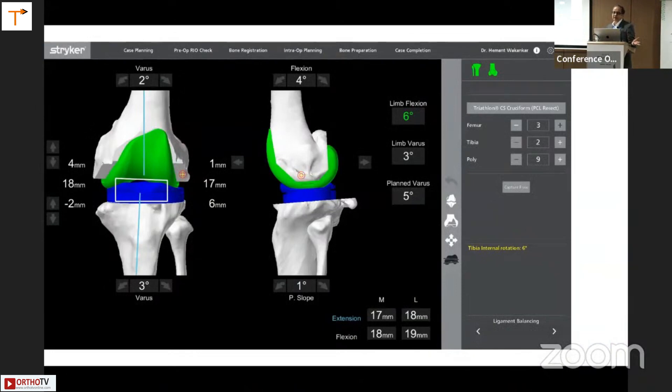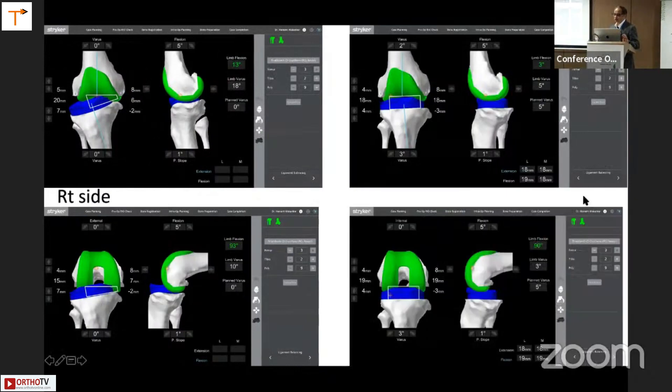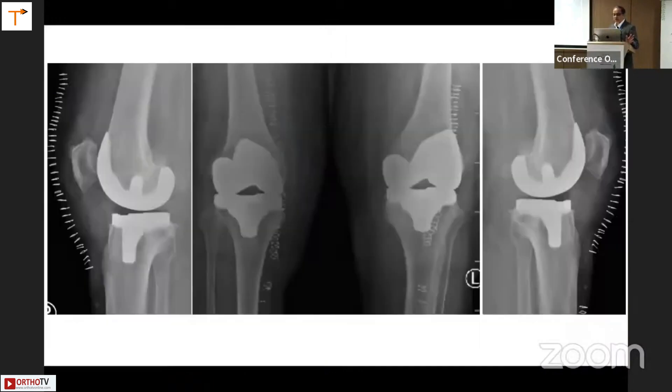The techniques for varus and valgus correction remain practically the same — you still have the options of doing reduction of osteophytes, doing posterior medial clearance. After all that, you are basically aiming for this screen — looking at the four figures at the bottom, aiming for 18 or 19 millimeters on the lateral side and a similar figure on the medial side, which tells us it is balanced. The planned varus here is five degrees — three degrees tibial varus and two degrees femoral varus. The current limb varus is three degrees, and it tells us we'll be left with minus two defect on the medial side. After balancing, these are the kind of screens showing 18 or 19 millimeters on both sides — a well-balanced knee. That is the postoperative x-ray of the same patient.